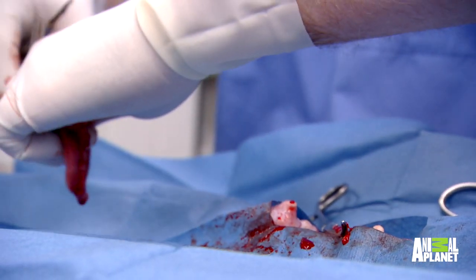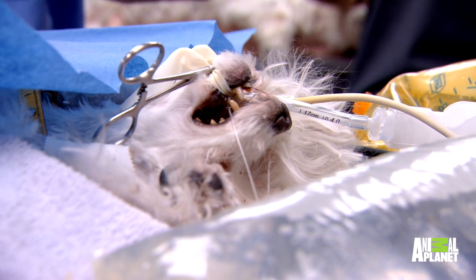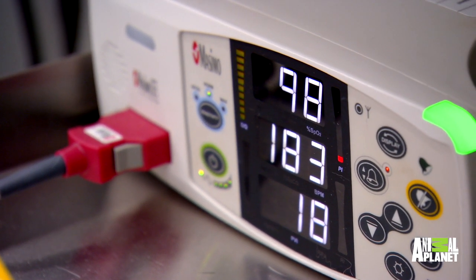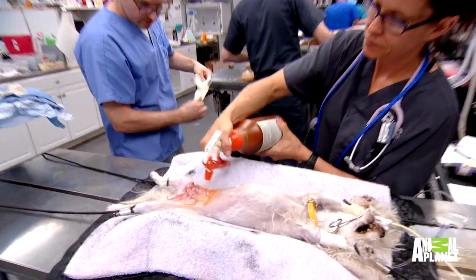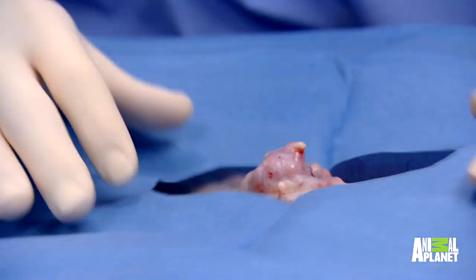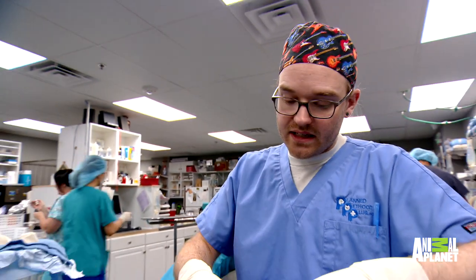So that's the spay over, which is good. Just close up the body wall and then we'll get that mammary mass out of there. Because she's so small, relatively speaking, this is a pretty big tumor that she has.